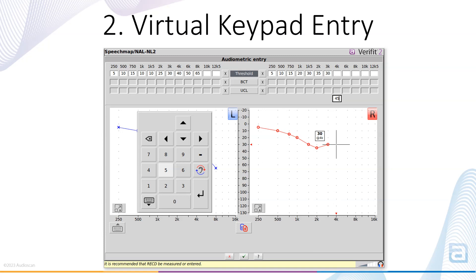The Virtual Keypad allows you to enter audiometric data thresholds via the Virtual Key buttons. The arrow keys allow you to move between audiometric frequencies, as well as go up and down in dBHL level, and the Virtual Number keys allow you to enter the dBHL threshold. Hitting Enter will automatically advance you to the next audiometric frequency.